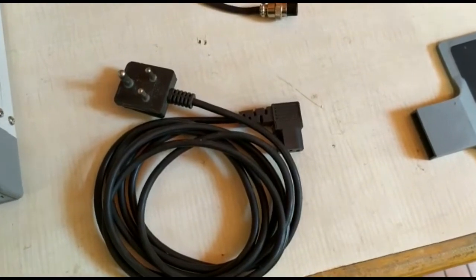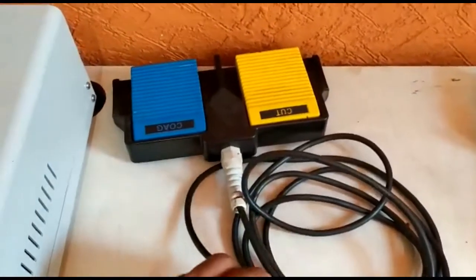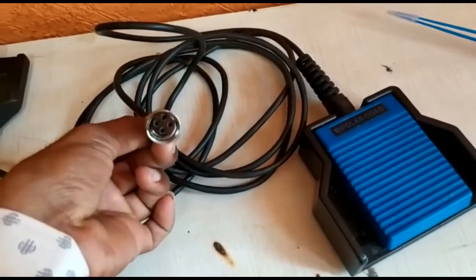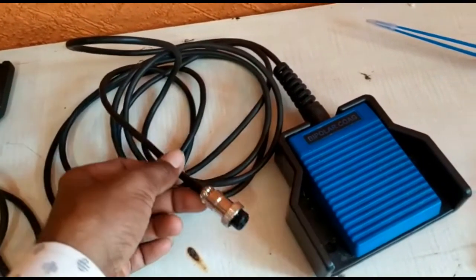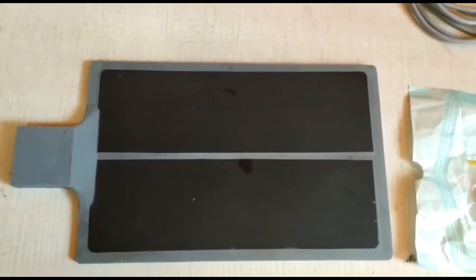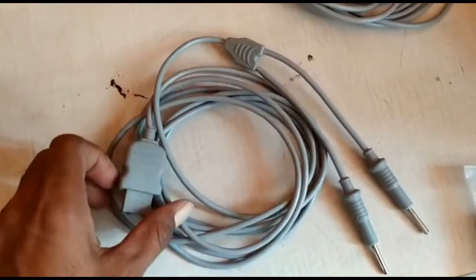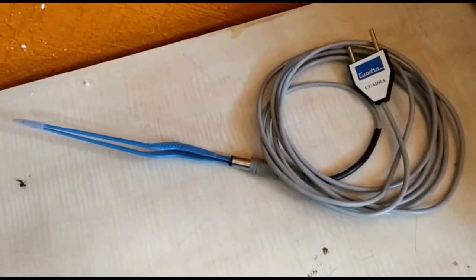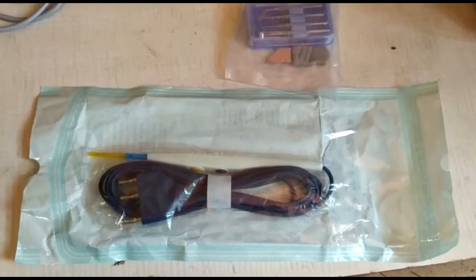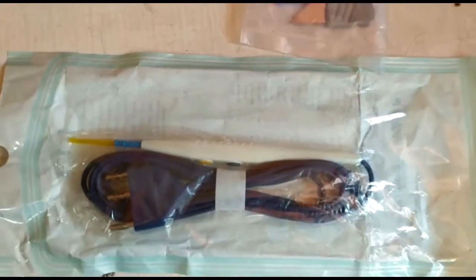The accessories included with the machine are: a power cord, a two-pedal footswitch used for monopolar, a single-pedal footswitch used for bipolar, a patient plate and patient plate cable, bipolar forceps with cable, and a monopolar disposable hand pencil along with an electrode set.